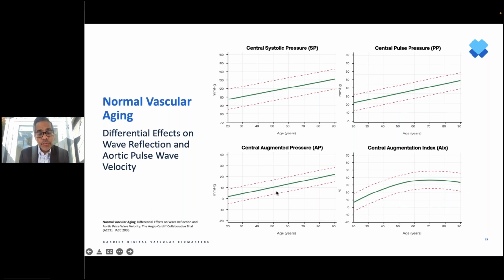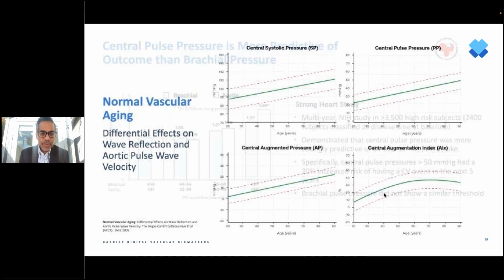And this is true for the arterial stiffness measurements. Augmentation pressure: how much of that wave was reflected back. If there's more stiffness out in the arteries, like blowing through that small straw, right, there is a greater augmentation pressure. And that augmentation pressure also computes an augmentation index that's individualized for that person. But these are taken together to understand that stiffness; arteries become stiff as individuals age.